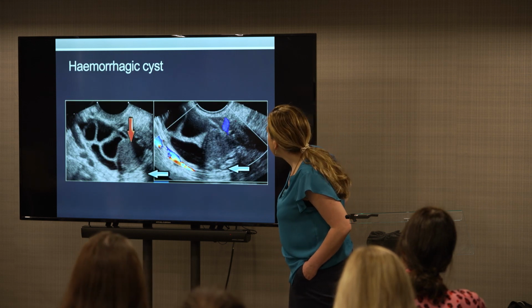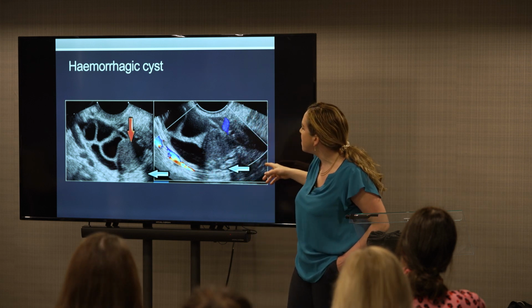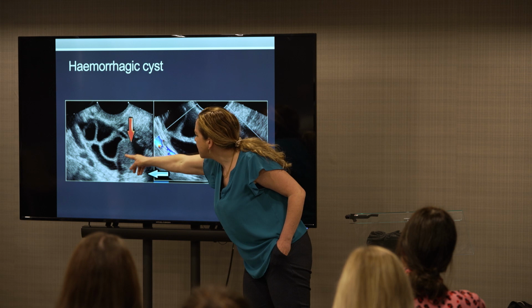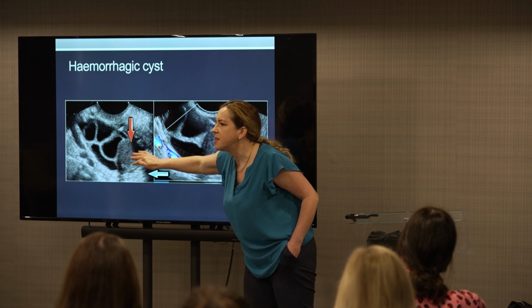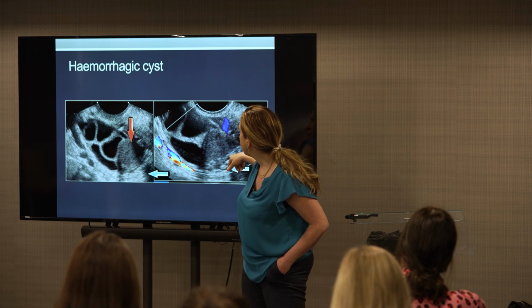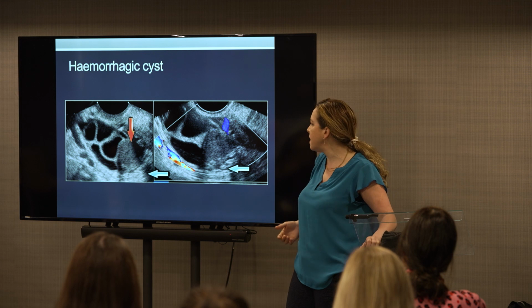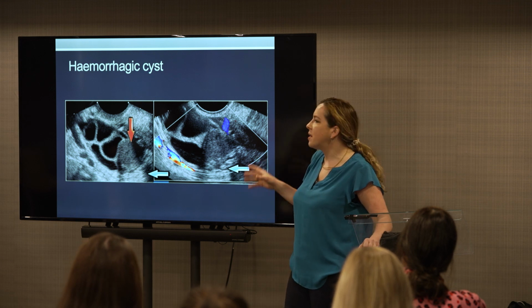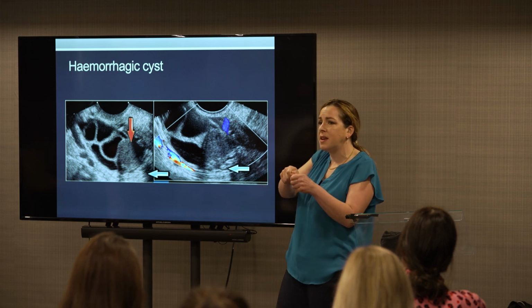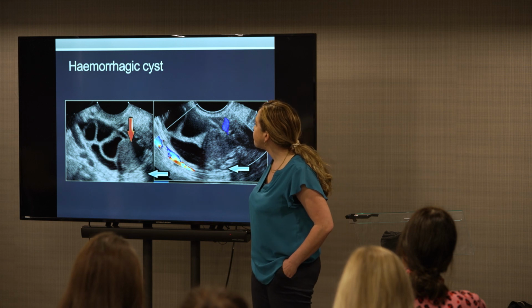Right, next. So this is also a cyst, but this is a hemorrhagic cyst. I think this is an ovary, this image. It's got particulate matter in it, so it makes it look solid, but it's not solid, it's a cyst. And then colour Doppler on and there's no flow in it. Sometimes it can be confusing in the thyroid and you have to put a needle in. But things with particulate matter, hemorrhage can look echogenic, but they're still cystic. If you put a needle in and aspirate, it still collapses. Next slide.